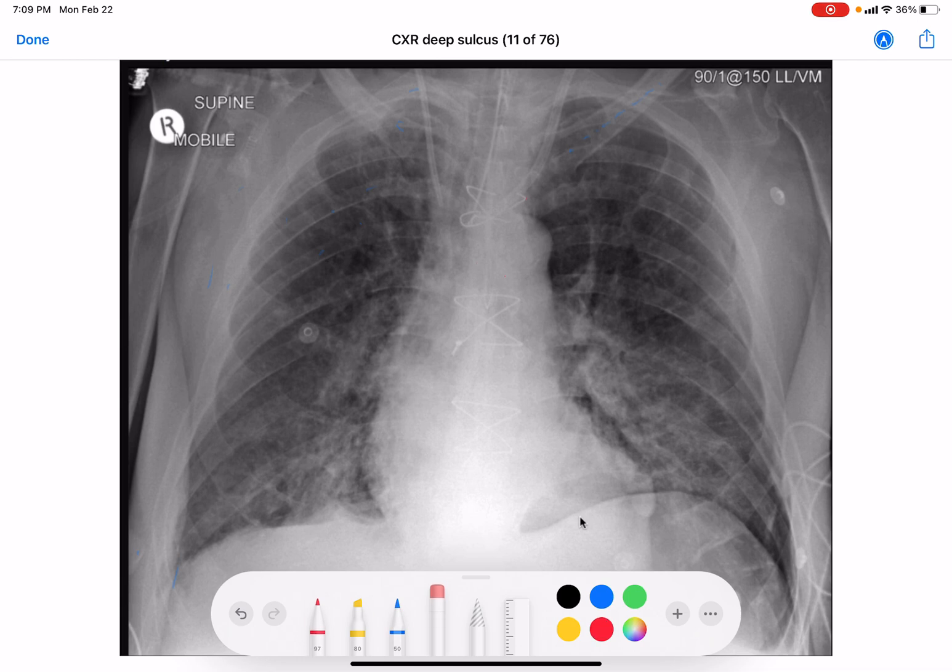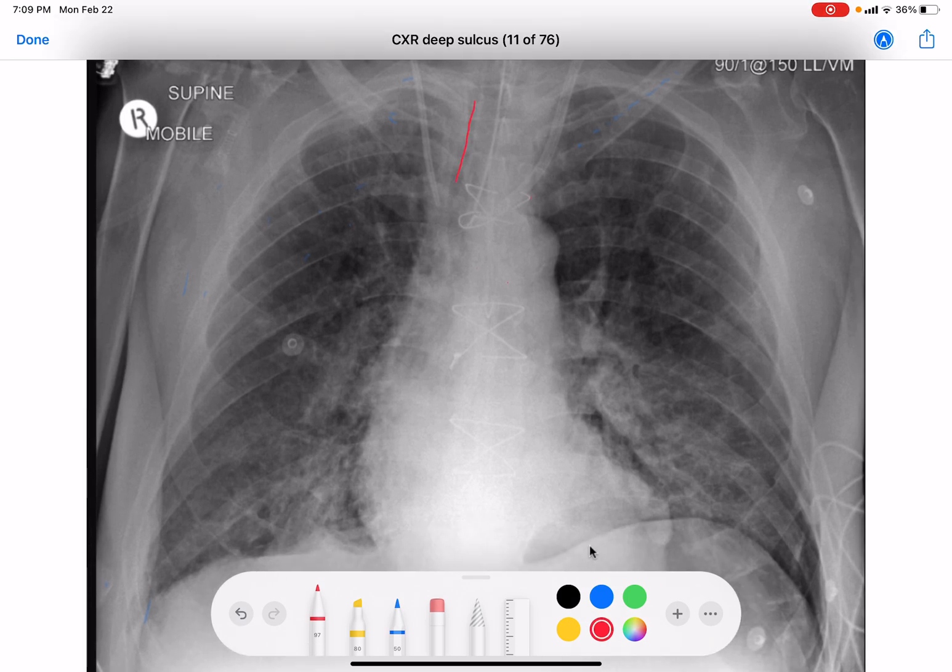Start with A for airway. Here is the trachea coming down here. You can see it looks like this is the carina right there. It looks like the patient shifted or twisted a little because the clavicles up here are off a bit — he's probably just turned, which is what makes the trachea and heart move over a little. I wouldn't call that a shift.